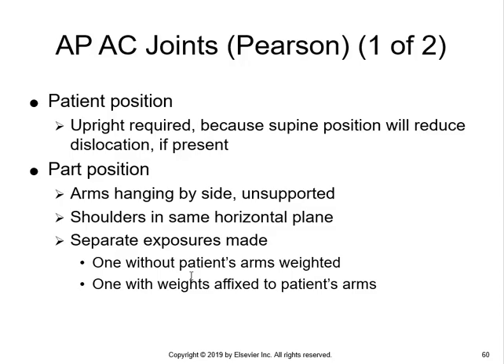If you don't, then you need to educate your patient. Hand them something heavy. Every hospital I've ever worked in just used barium jugs. Hand them the barium jug and tell them that you want them to relax their shoulders and let the barium jugs pull their shoulders down. It's going to hurt, so you need to have everything set up before you hand them the weights. The last thing you do is hand them the weights, trot back, make your exposure, and tell the patient immediately they can let go of the weights.